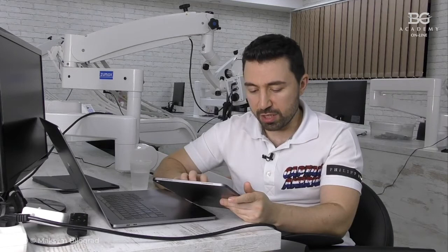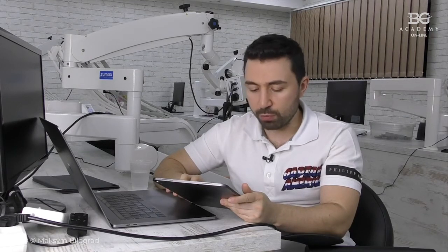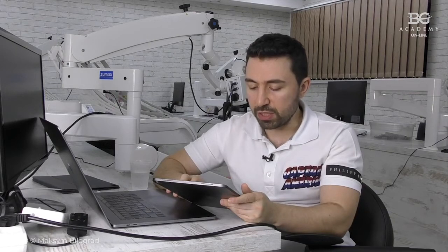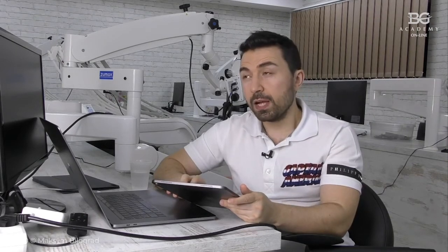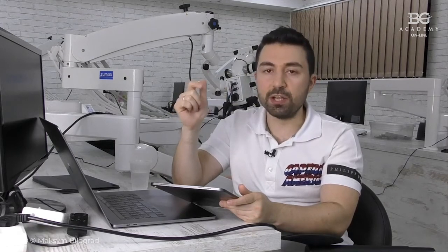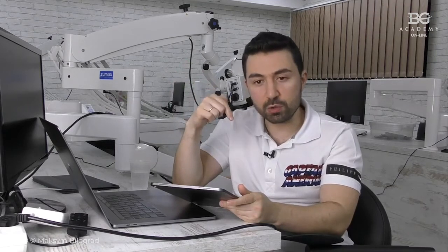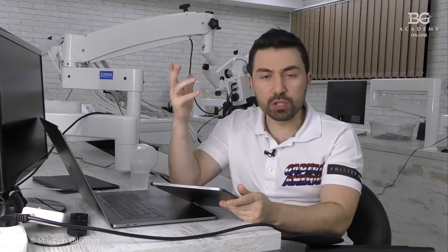Question from Ash. Would you ever do upper veneers where the lower incisor edges meet the veneer surface when the patient closes in maximum intercuspation, instead of the ideal of having the lower incisor hitting the upper palatal? So basically we have 3 points of view for that issue. First of all, some people say that ideal is if tooth will touch tooth, when the opposite tooth will touch the opposite tooth surface.